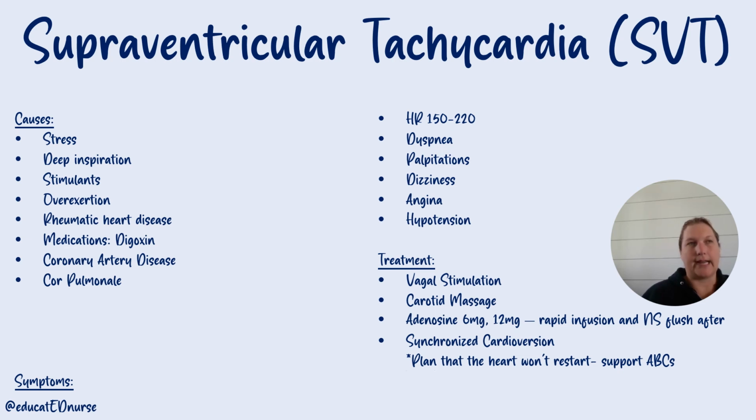If you have time, if the patient is somewhat stable-ish, it's really nice to give them a little sedation before you do this. Otherwise, if it's emergent, you might not be able to sedate your patient. When you put the pads on, they go one on the front, one on the back, and some will do upper right, lower left, kind of like defib pads. Our docs like to sandwich the heart, one on the front, one on the back of the chest.